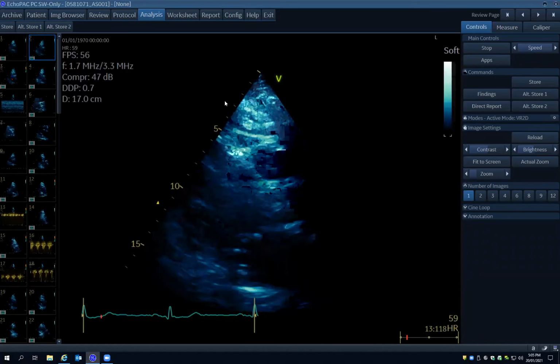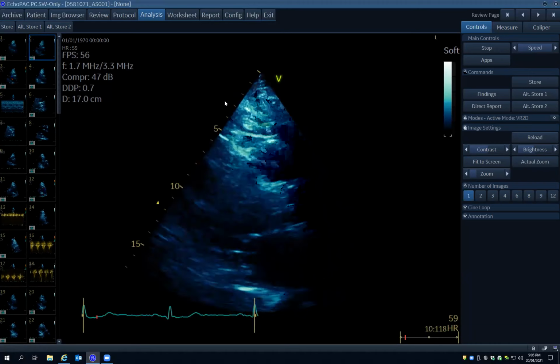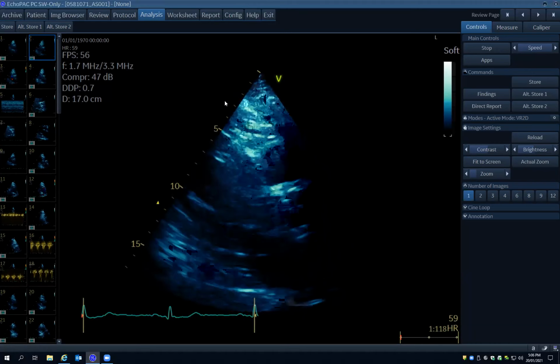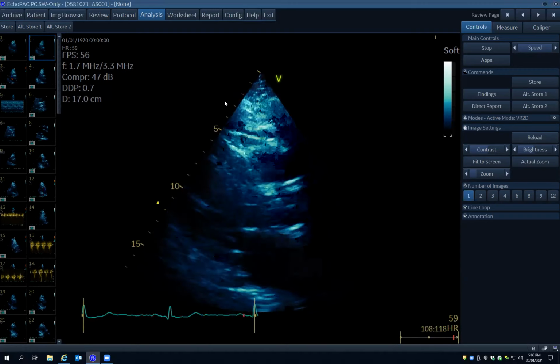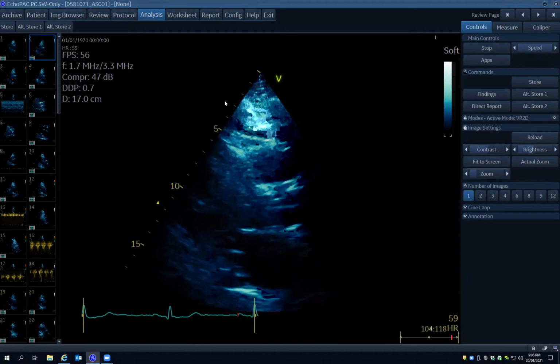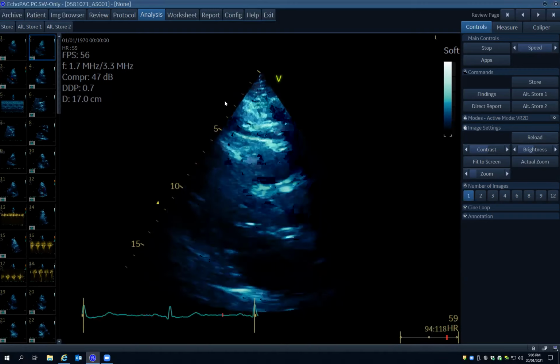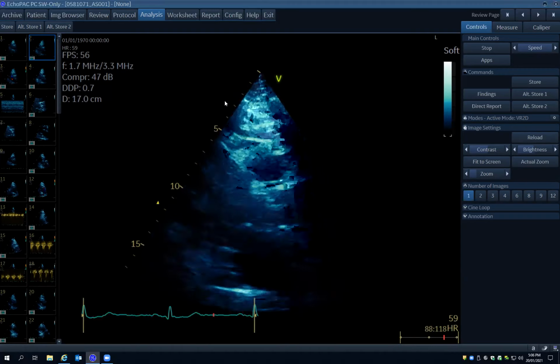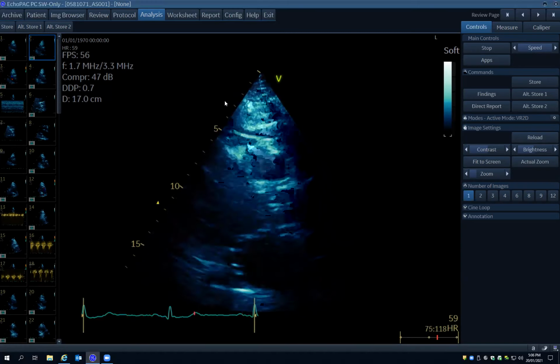Looking at it, it's hard to assess LV systolic function, but it looks to be preserved. My feeling is, and you measure this, but the LA diameter would be increased, and it's a surrogate measure. The aortic valve, though poorly visualized, looks to be calcific, thickened, and the word we would use is sclerotic, and it's very difficult to look at excursion here. Importantly, the RV is not enlarged, it's functioning well, and there's no pericardial effusion.